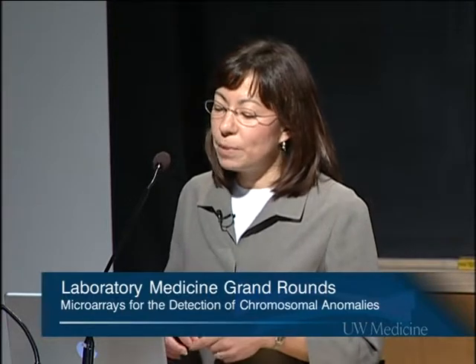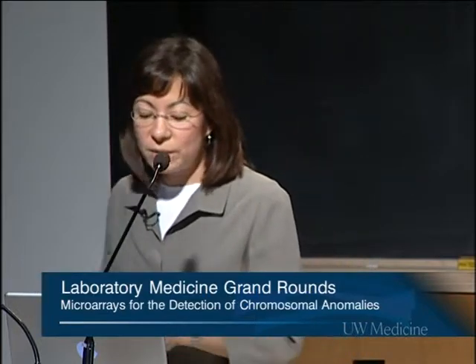So what this group did was they screened a bunch of patients with CHARGE syndrome using Array CGH. And they identified a deletion in the long arm of chromosome 8 in a few of their patients. And actually, most of their patients didn't have a deletion in that region that you could detect by Array CGH. But when they sequenced the coding region of all the genes that were in the common region of overlap of deletion in the two patients that had it, they found that a very high percentage of patients had mutations in the CHD7 gene. So this allowed the determination of the etiology of CHARGE syndrome in the majority of patients.